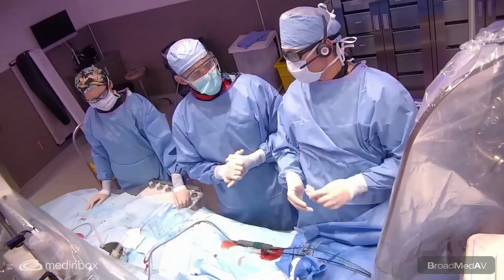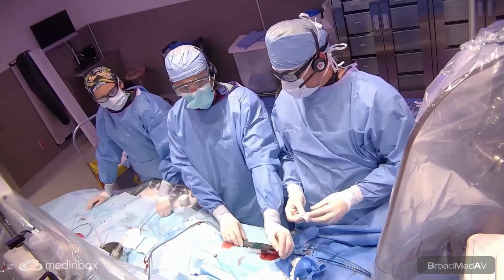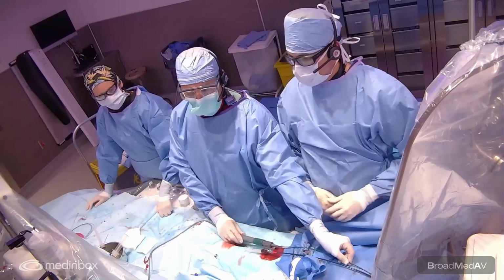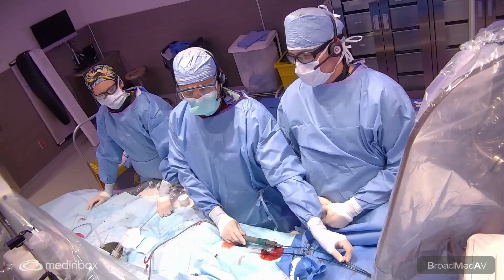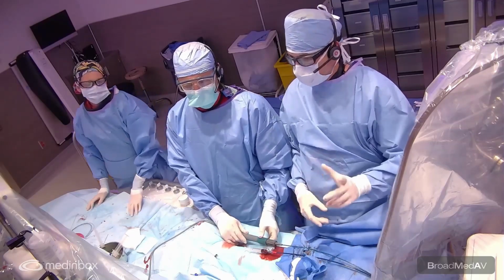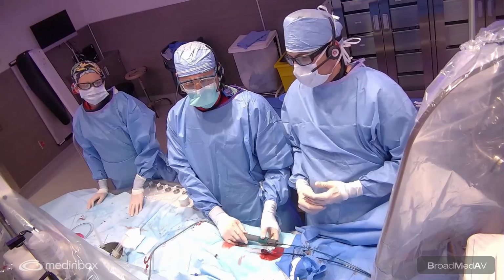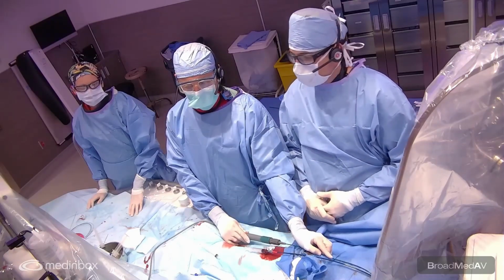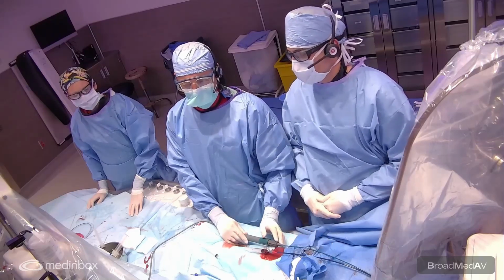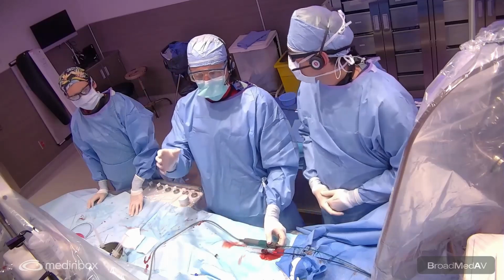I think this case highlights how important pre-procedural planning is, and reviewing the TEE images and all the malignant features of this particular anatomy. We were ready to use the ICE because we knew that it would be important to fully ascertain that we got all the defect with the device, but then also how we chose to adapt with the information that we got today, specifically with the sizing balloon and the size of the defect.